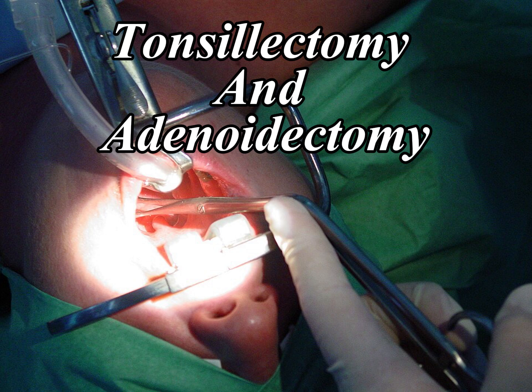Caution: avoid overly aggressive curettage to prevent injury to the eustachian tube openings or excessive bleeding from the pharyngeal venous plexus. Hemostasis is achieved using suction cautery, topical vasoconstrictors, or pressure and hemostatic agents.